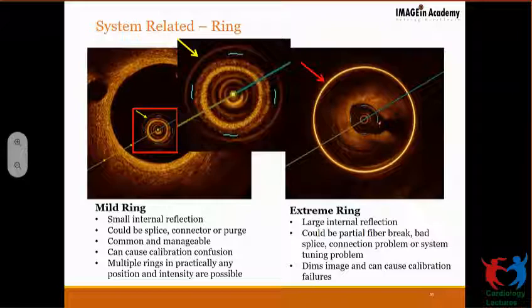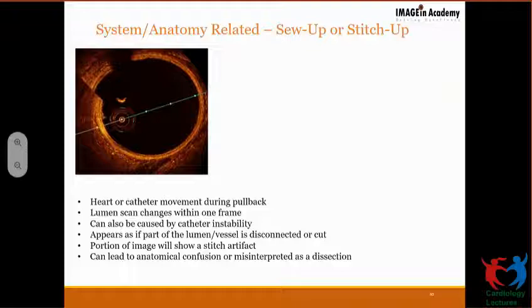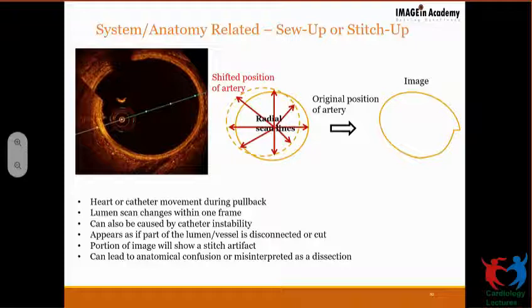Now you can also have a sew-up or stitch-up artifact, which is primarily linked to the motion of the vessel. If you have an extremely tortuous vessel, or a catheter which is reused and rotates faster and is not synchronized. In the lumen scan, the catheter moves and shifts its position, so you'll feel as if there is a stitch-up, or the vessel is broken at that part, or a certain part of the vessel is disconnected. No, the vessel is not disconnected. It acquired a round image here and another image, and these overlapping images are not falling at the same point, so they have axially shifted. There is a shift in the artery, as you can see here, and the shift gives an impression as if there is a break in the vessel wall. This is called a sew-up artifact or a stitch-up artifact. You need to acquire the image again, or maybe change the catheter.